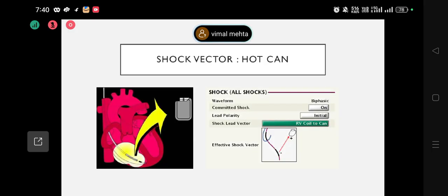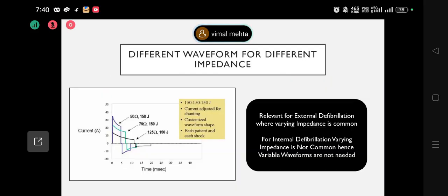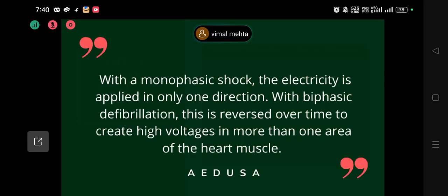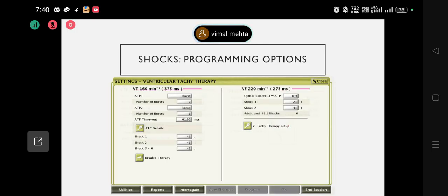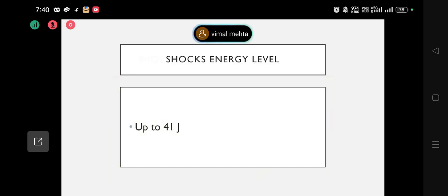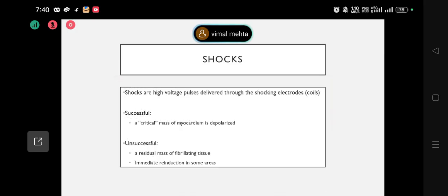Let us say the patient has a recent fresh MI and continues to develop complications. So it's a combination of factors many a time. When you implant, you do not tell the patient that we have given you immortality. There are various scenarios, and you can have a whole class or discussion on it, where despite the ICD functioning beautifully, ultimately the outcome may not be favorable.